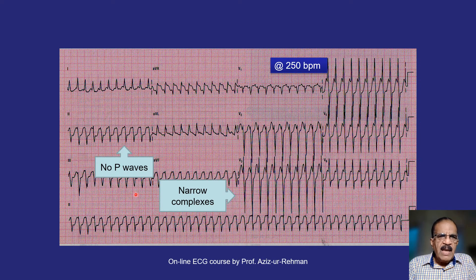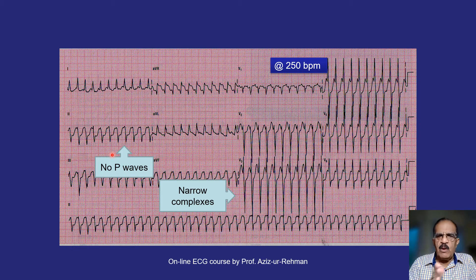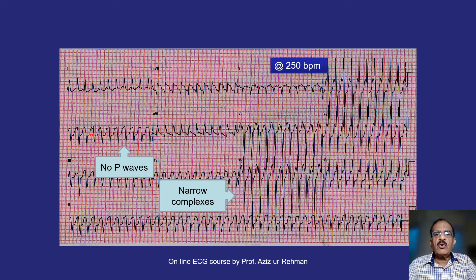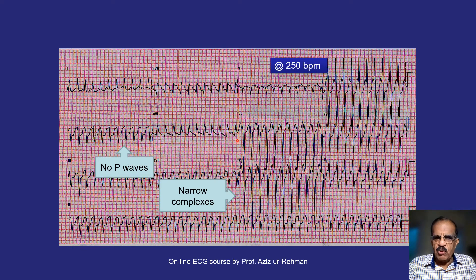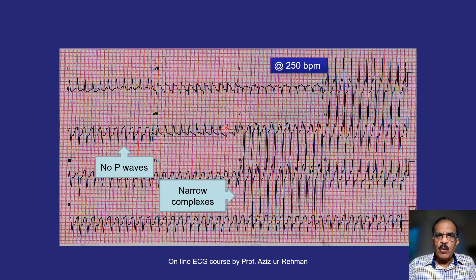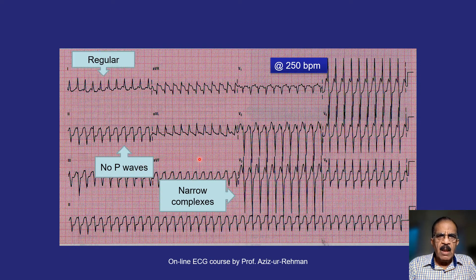The heart rate here is 250 beats per minute — 1500 divided by the number of small squares between two R waves gives 250. This is much faster than expected in sinus tachycardia. The QRS complexes are narrow, and — importantly — P waves are not visible. In SVT there is atrial depolarization, but since this is an AV nodal phenomenon, the atria depolarize at essentially the same time as the ventricles, so the P wave is merged into the QRS complex.